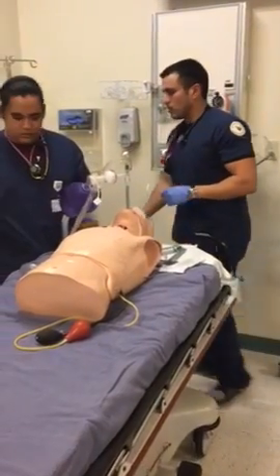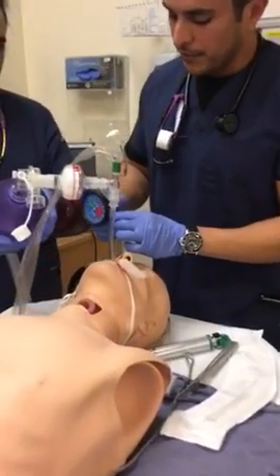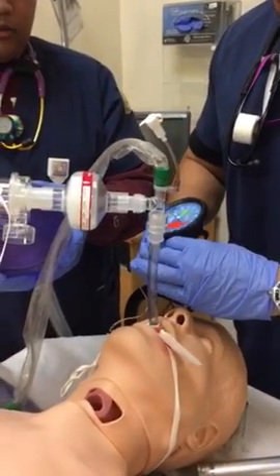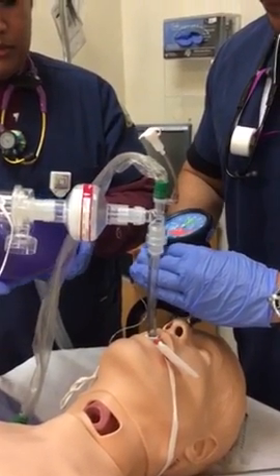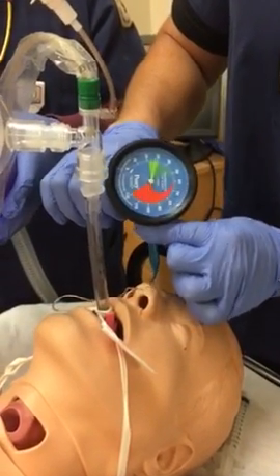We would also be checking the pressure on the cuff. Again, we would want it about 25 to 30. So right there would be about good.